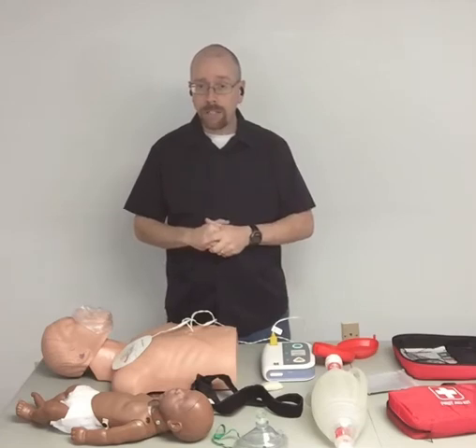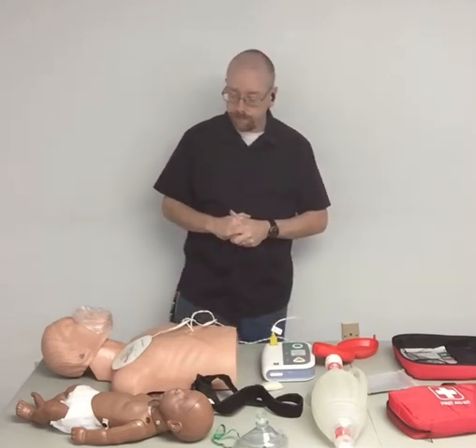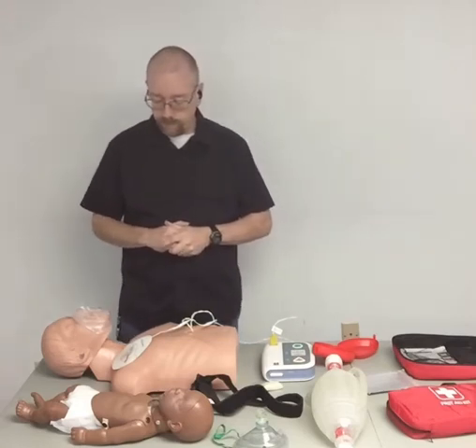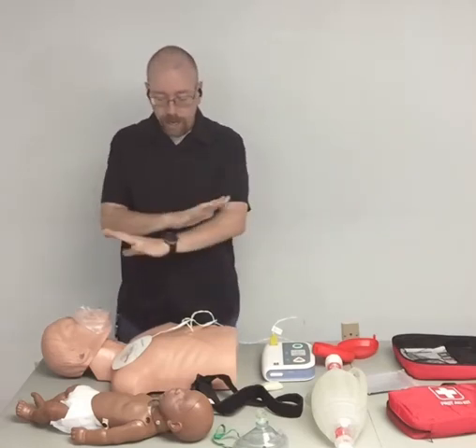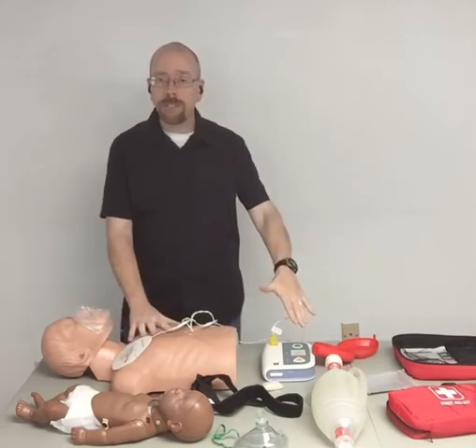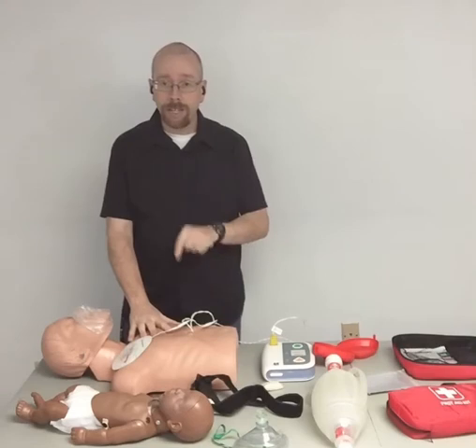We'll talk about that a little more in depth in a second. Stay clear of the patient. Deliver shock now. Press the orange button now. Everybody stand clear. We want to have no hands-on contact when we hit the shock button because somebody could possibly get shocked.